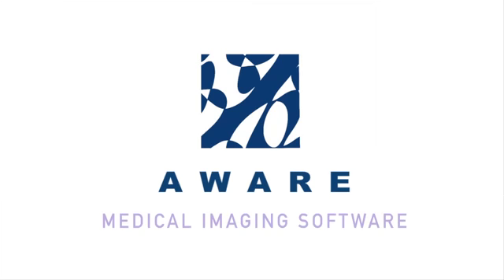This has been a presentation of Aware's AccuRad REM Server.